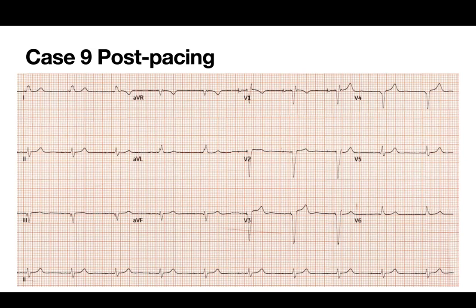The anode was not in. But this guy's septum was not very thick, about 8 millimeters. But for sure, the anode was not in. I knew that, because I've had a couple of cases where the septum was not that thick, and I would do a couple more turns and end up on the other side. I didn't screw that many times, but sometimes it depends on how you enter the septum and how thick the septum is.